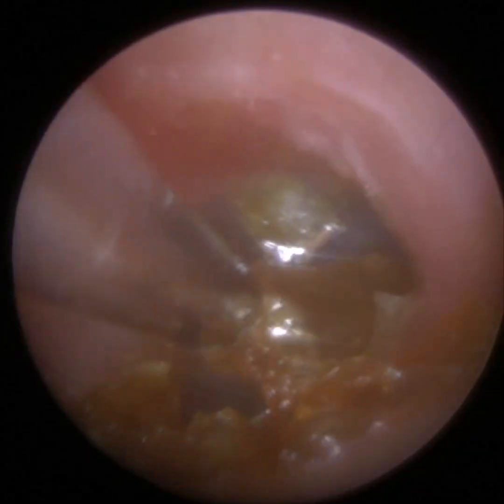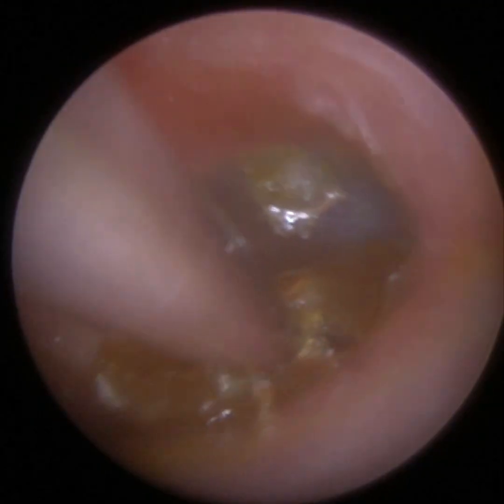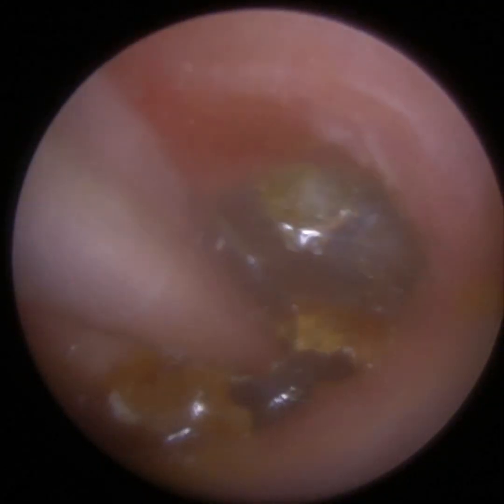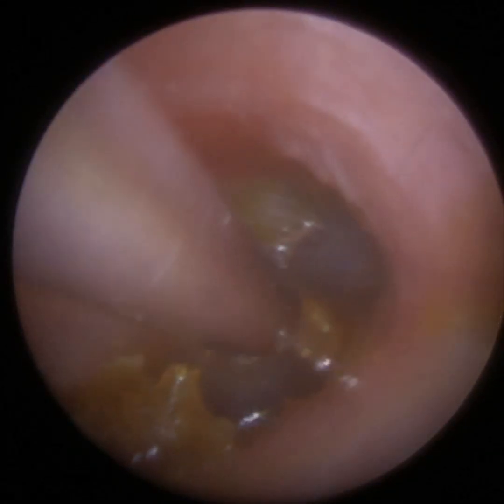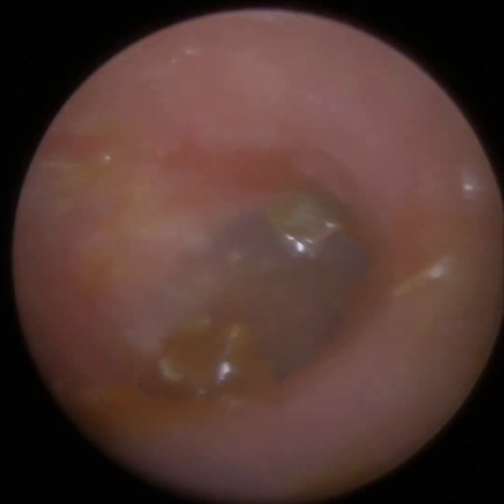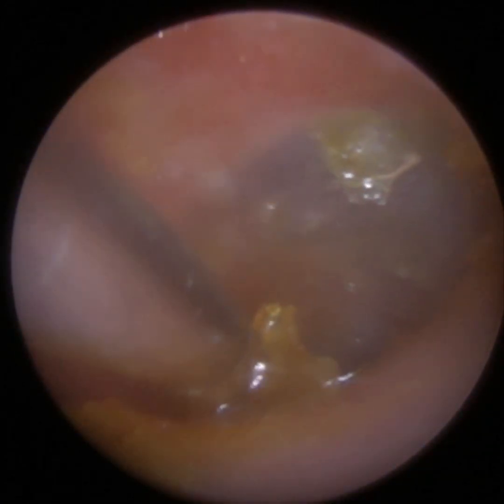So here's some skin at the bottom, and it's hidden away. Where the ear canal goes downwards, it creates a little trench, which is sometimes not visible to the naked eye. And you've got all this skin. You'll be quite surprised in a minute by how much skin actually came out. Even I was a bit surprised. And that's going to help the patient because that skin wasn't going to come out by itself. So we've got it out for him. At least this way, it will hopefully be a bit longer before the next time he has to reattend again.